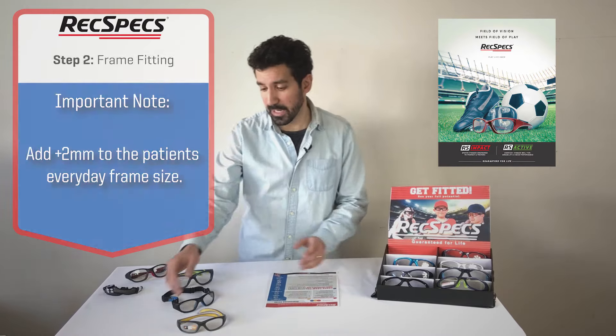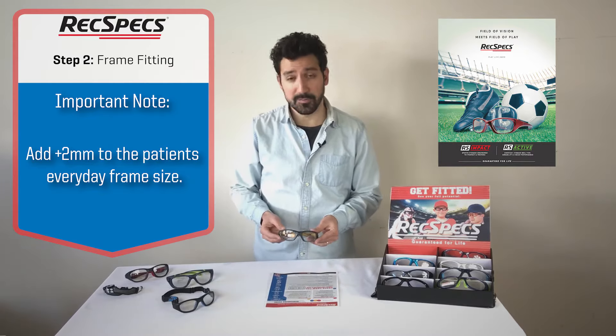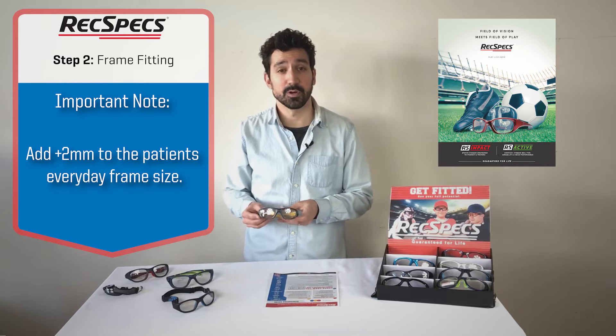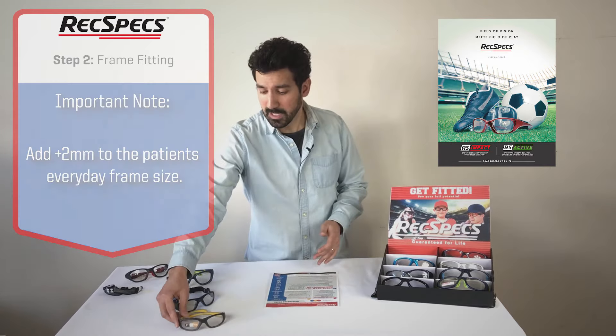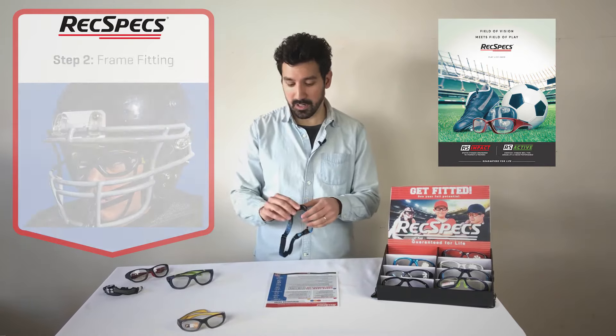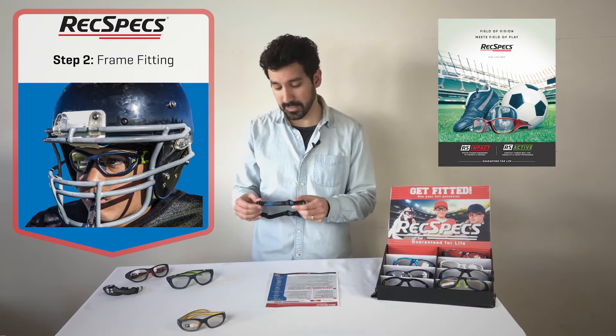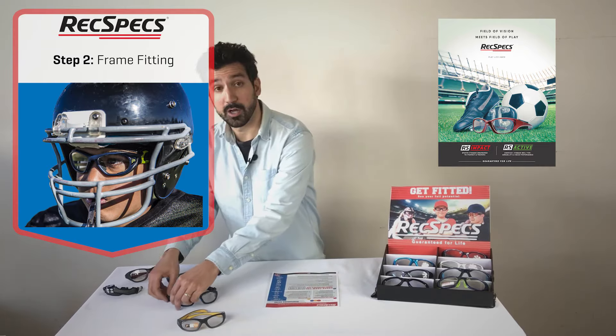What you'll see here is an assortment of styles that we have and that we offer. Frames being the first one here — this is a versatile solution that works for actually most sports. Then we have our goggles, which are actually recommended for use with helmets because they tend to be a bit more comfortable when worn under a helmet.